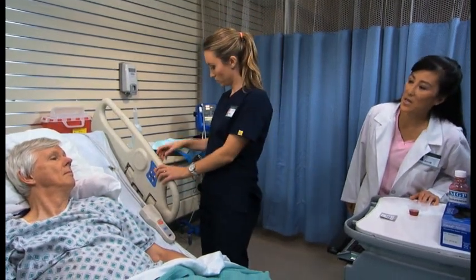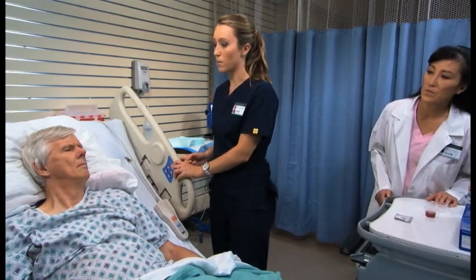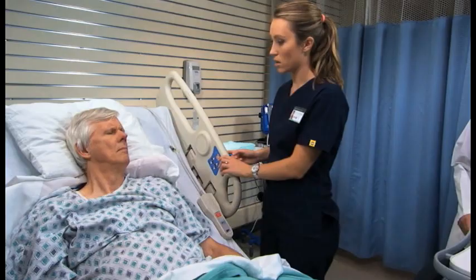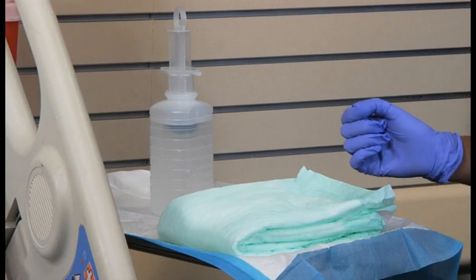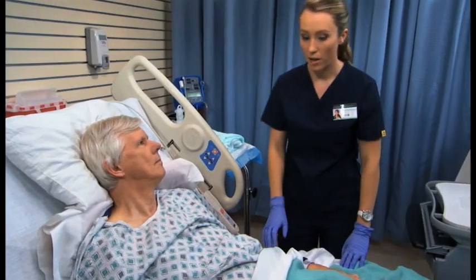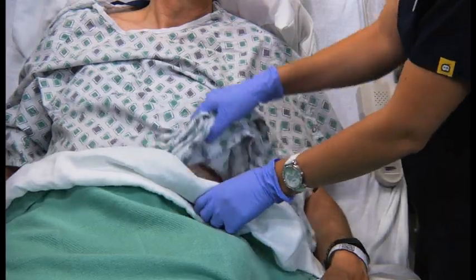Now he should be sitting up as upright as possible. Okay, I'm going to raise the bed up a bit. A little more. How's that? All right? Now remember your gloves. Now walk me through what you're doing. Well, I already changed the irrigation set and filled it with fresh water. Mr. Lumet, is it okay if I move your covers and gown? Let me put this pad under here.